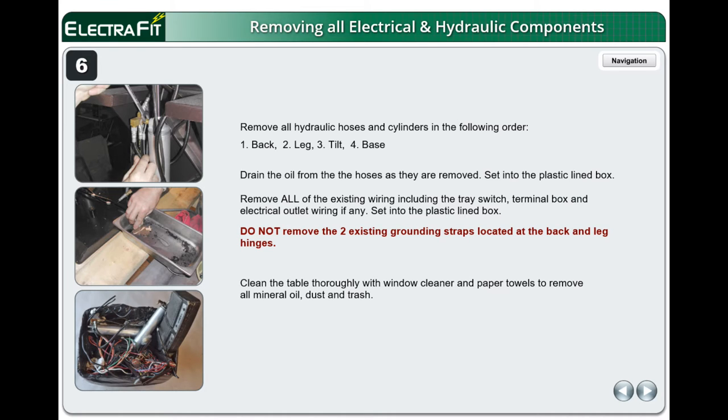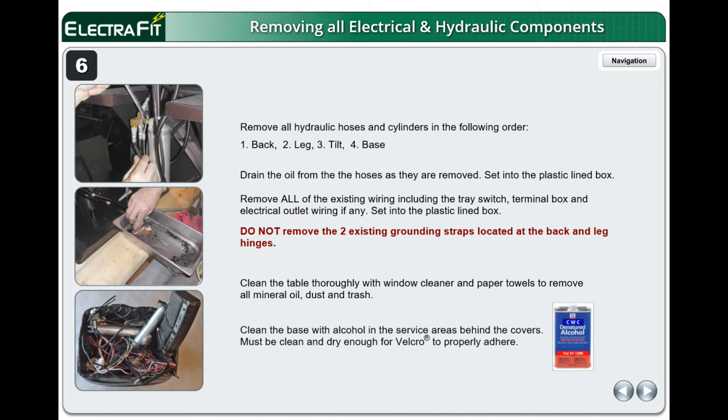Clean the table thoroughly with window cleaner and paper towels to remove all mineral oil, dust, and trash. Clean the base with alcohol and the service areas behind the covers. These areas must be clean and dry enough for Velcro to properly adhere.